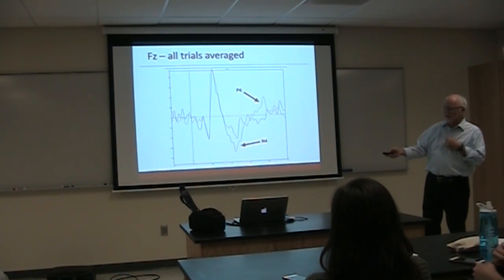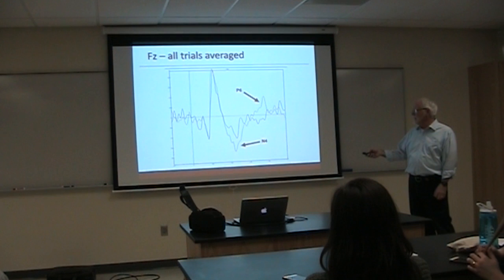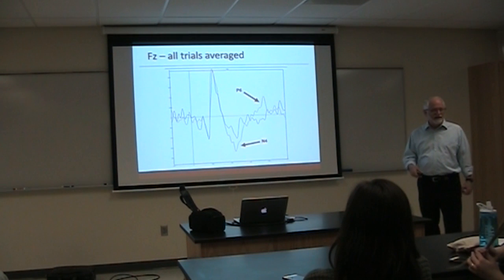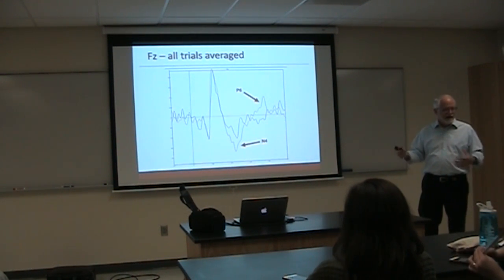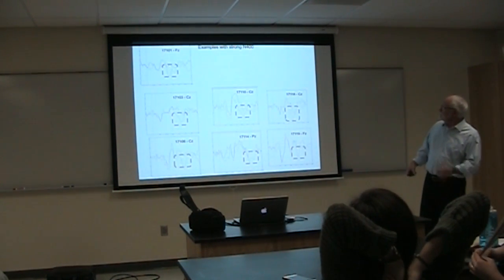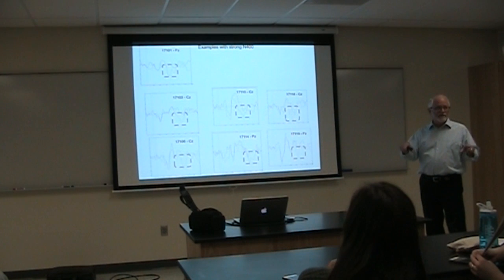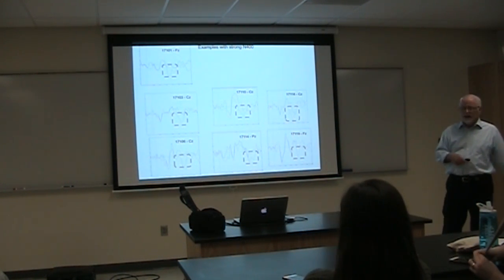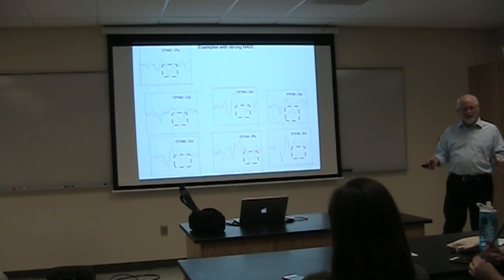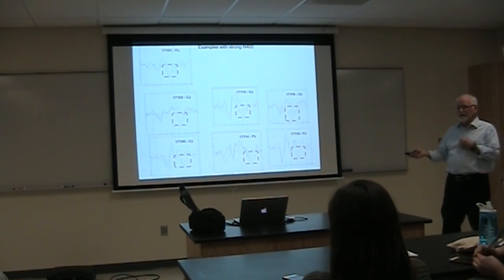Okay, as I pointed out in the lab, the black line always represents the normal sentence, the correct sentence. This is the average of 80 trials of normal sentences. The pink or red line represents the nonsense sentences, the average of 80 trials of nonsense sentences. Okay, so here we have, this is spring 17, and so I've got the data from the people who were actually participating over the past 2 months. And so you don't know what your number was, and no one else does, so you don't need to be embarrassed. But as I looked at them, we got some really strong examples of N400 here.